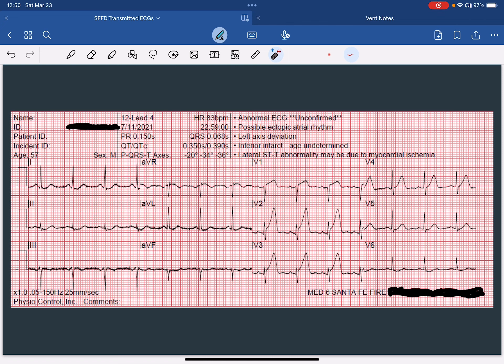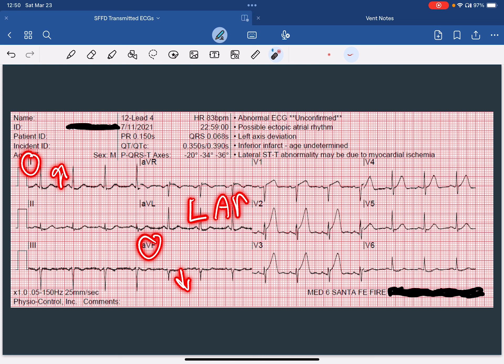From there, let's look at what the cardiac axis is doing. We'll evaluate lead 1 and lead AVF. Lead 1's orientation is predominantly electropositive, whereas lead AVF's orientation is predominantly electronegative. And so we have a left-axis deviation.